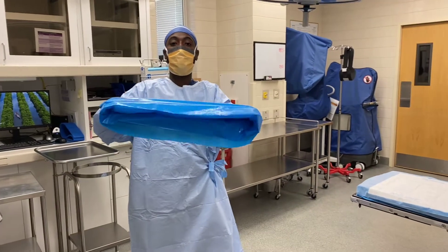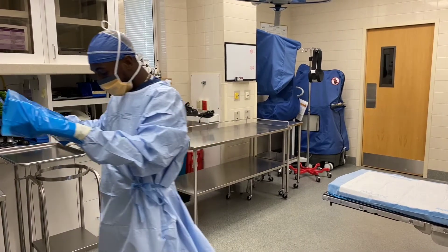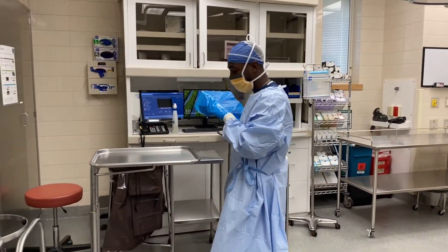Now you see that it has a hole right there. I tend to take my fingers and kind of open it up a little bit, and then usually I take my left foot and put it on the stand to keep it down on the ground, keep it firm.